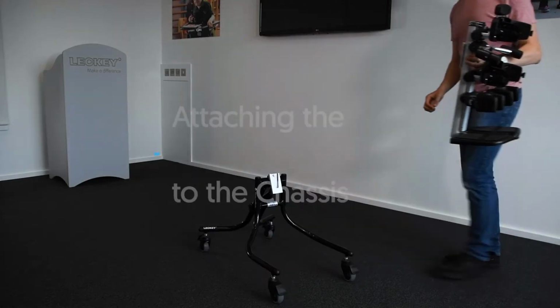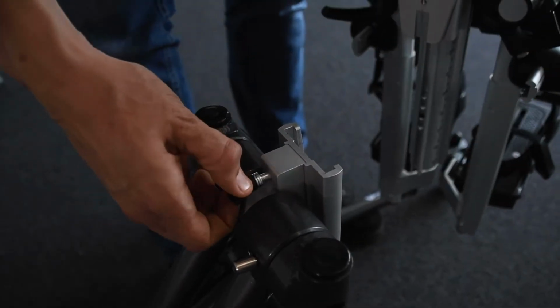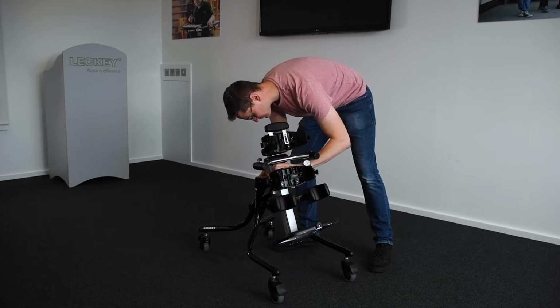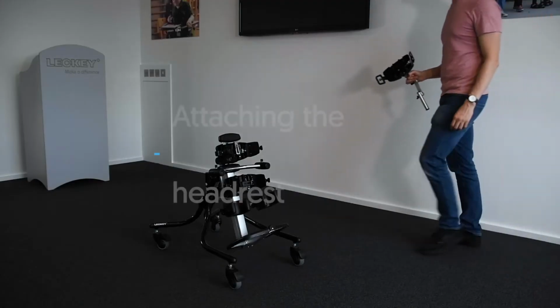To fit the Squiggles Stander shell onto the pivot chassis, firstly apply the brakes. Pull the locking pin out, slide the central spine into the receiving bracket until it is fully engaged, release the pin, allowing it to snap back into place.